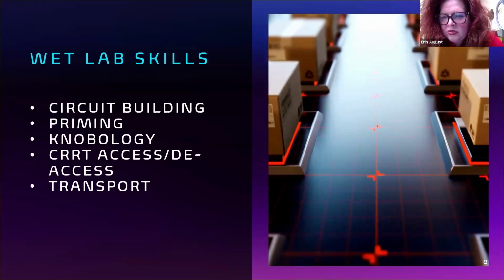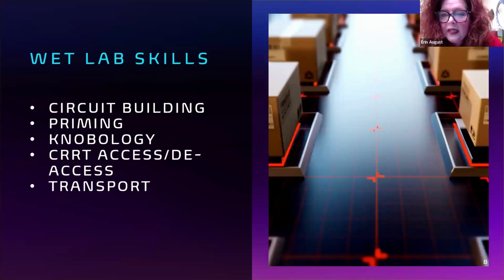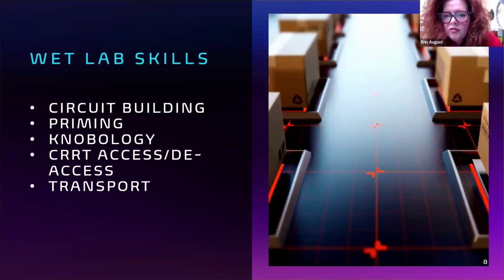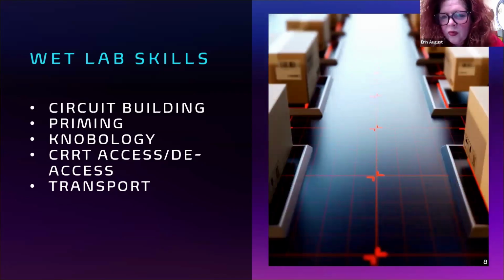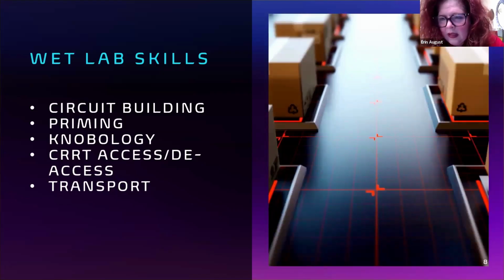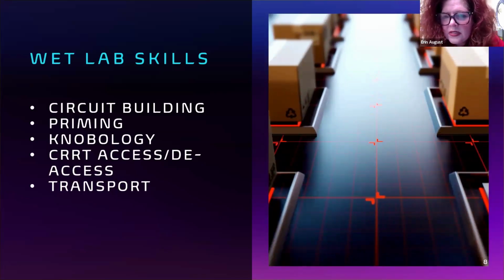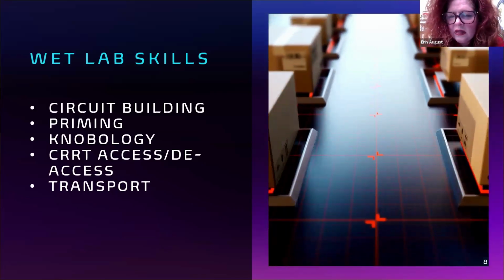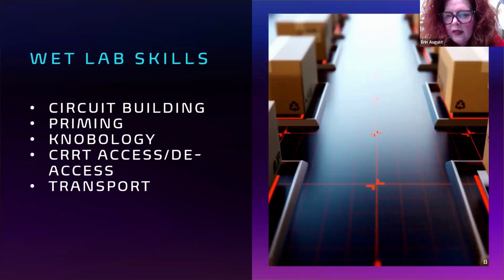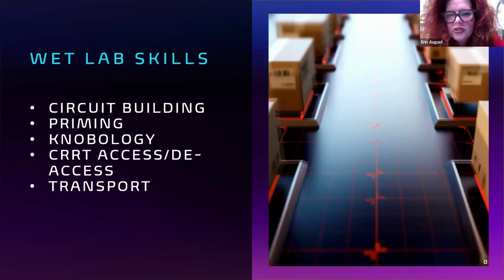So in addition to having these elements of a wet lab skills for the ECMO specialist, it's also good to have competencies for what we would call ECMO knowledgeable, which is your bedside team. Everybody has a role and responsibility in an ECMO emergency and an ECMO initiation. So it's important to know and understand and define who is doing what in what situation.